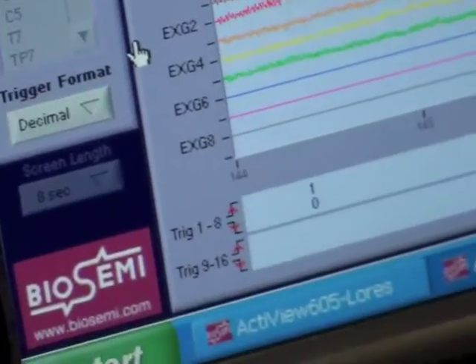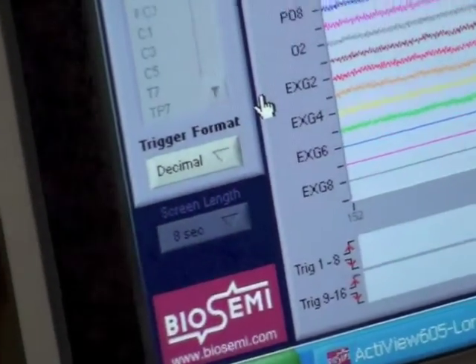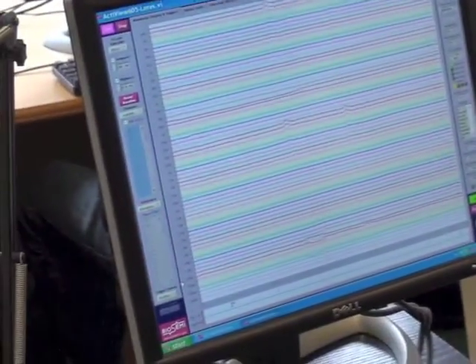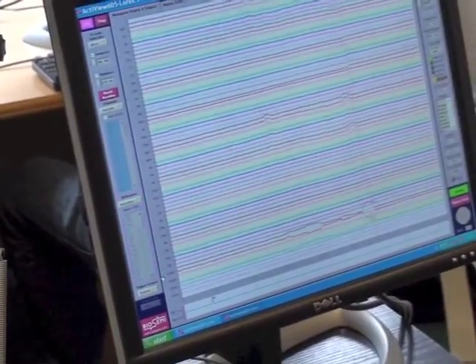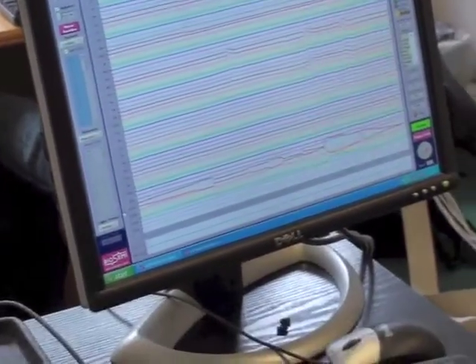When I programmed this, I programmed it to give triggers, so that every time your own face came up, a number, this would say number 1, every time it was a friend's face it'd say number 2, every time a stranger's face number 3, a flower number 4, and every time it was a repeat response, it would say 250 or something different, okay? And every time you press space, it would say something else.